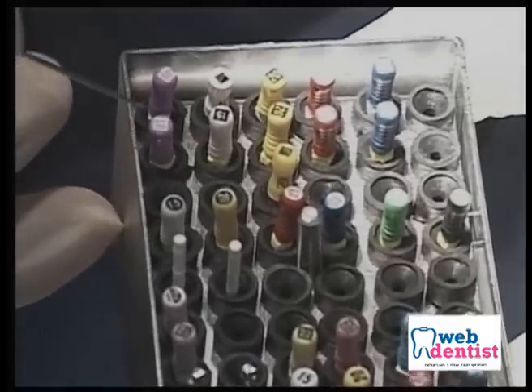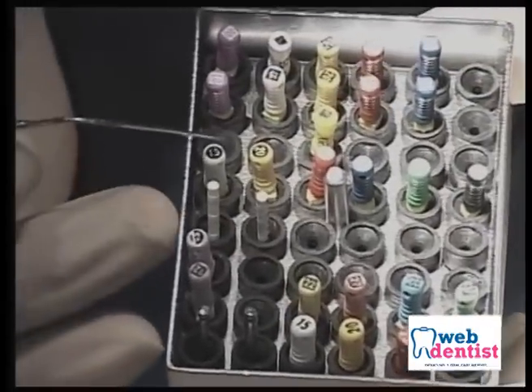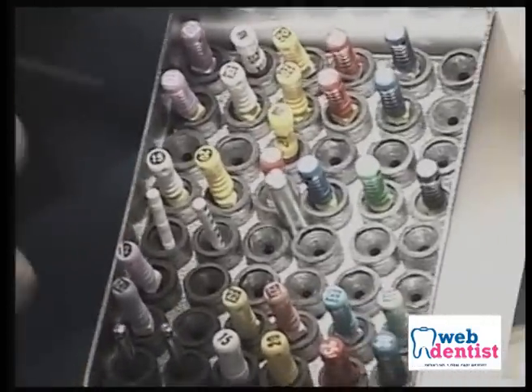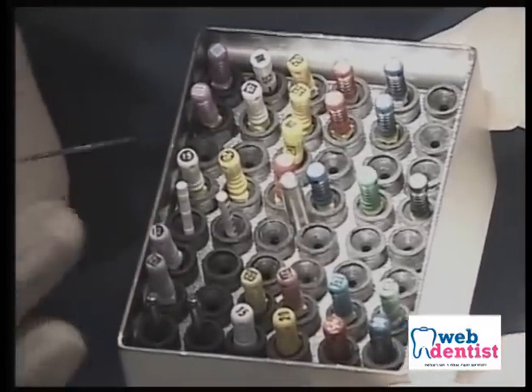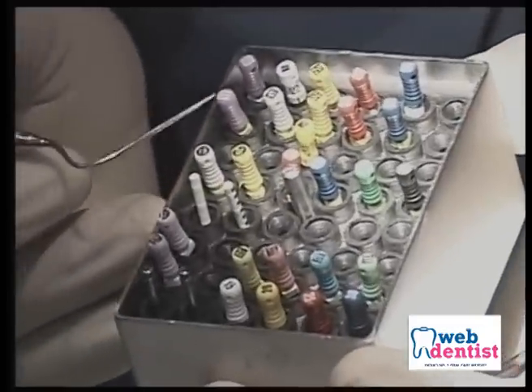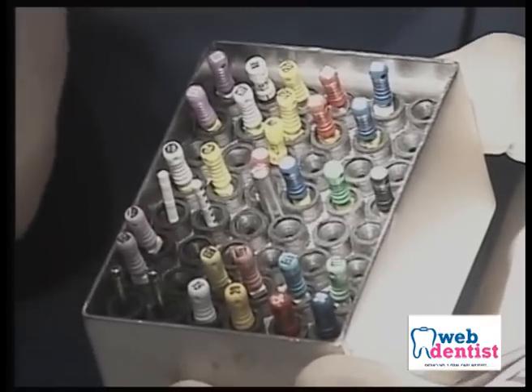21 mm and 25 mm. I'm carrying some H files as well. I love to use H files, especially to remove the pulp tissue. Now some people have fear of using H files. Yes, they tend to break. There is one simple thing we need to understand about H files. H files are always used in a circumferential filing motion.